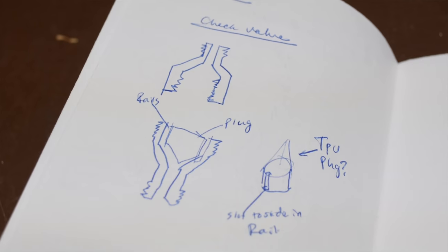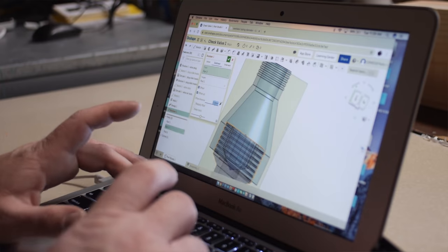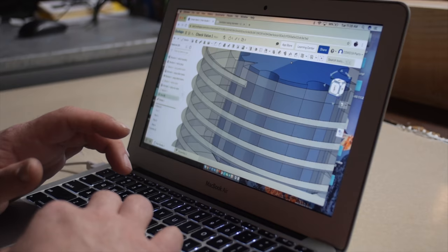So he's designing this check valve, and he has an initial design, but it's pretty beefy. It uses a lot of material, and it would take hours and hours. He says maybe upwards of 10 hours to print one of these. So he's in a revision phase right now, trying to design a simpler design that takes less material and can be quicker to print. And we were also kind of discussing alternative designs like diaphragm type check valves, flapper valves that might be simpler.